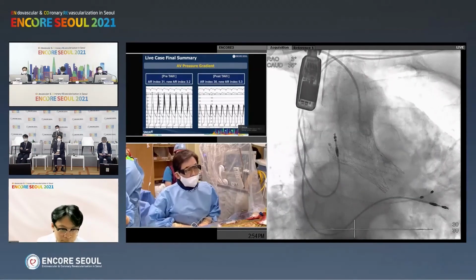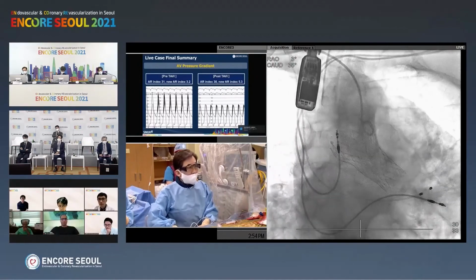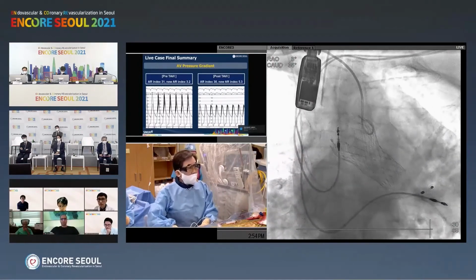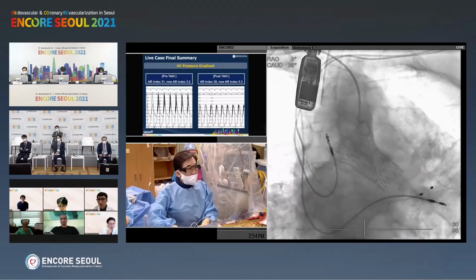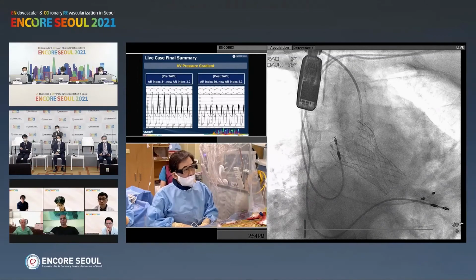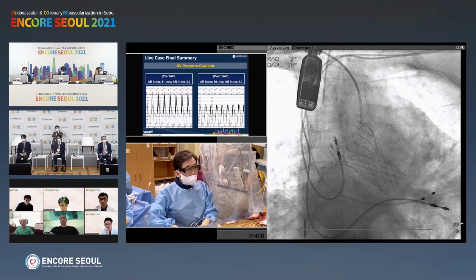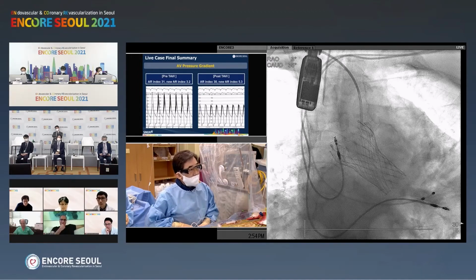I have many cases of coronary protection with insertion of a guiding catheter. Old cases ended without intervention of the left main. Thus, my principle is to engage a balloon catheter, not a stent, because if we engage a stent, it is discarded and not reimbursed. Thus, to save money, I always insert a balloon catheter, cheaper than a stent.